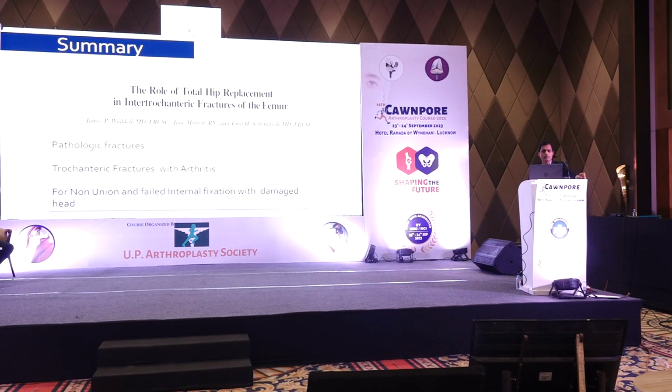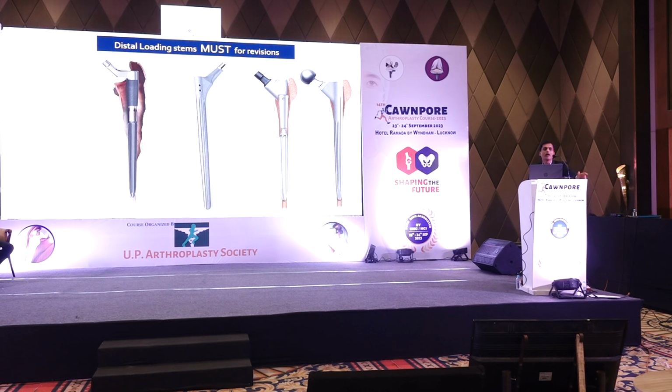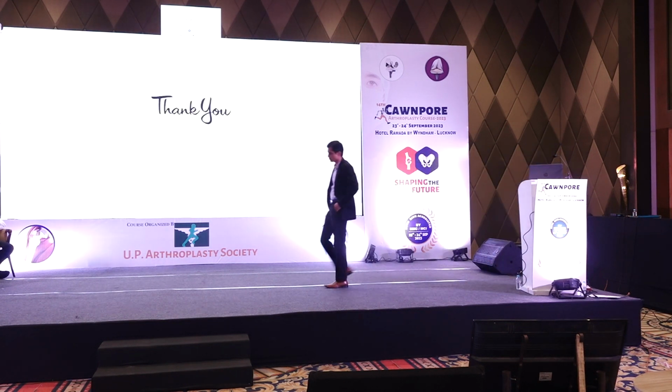So to summarize, all proximal femur fractures, either pathological, unstable trochanteric fractures with arthritis, non-union and failed internal fixation, THR is the ideal solution in these kinds of situations. And always remember, when you are dealing with this kind of complex situations, the go-to stem should be an uncemented distal loading titanium stem. No more cobalt chrome stems. Thank you.